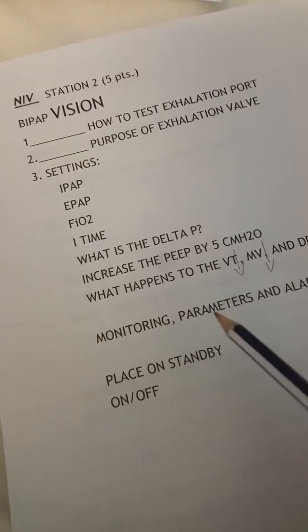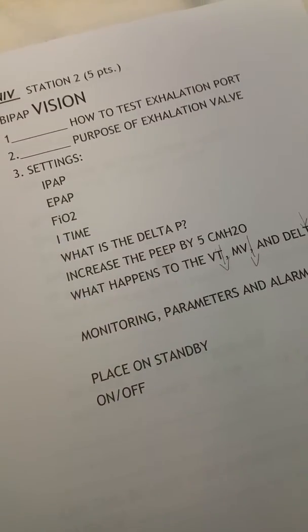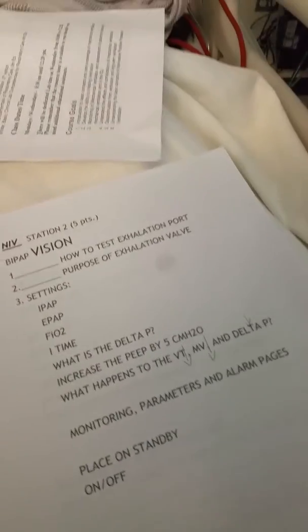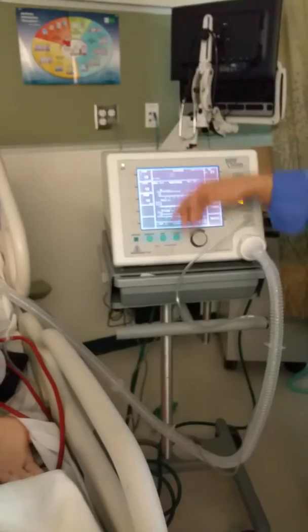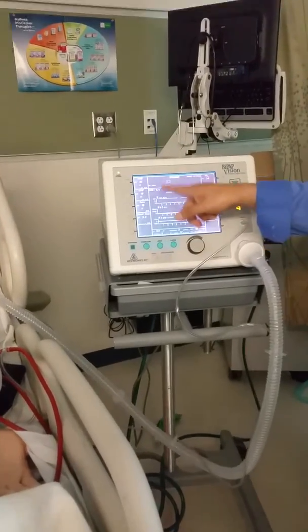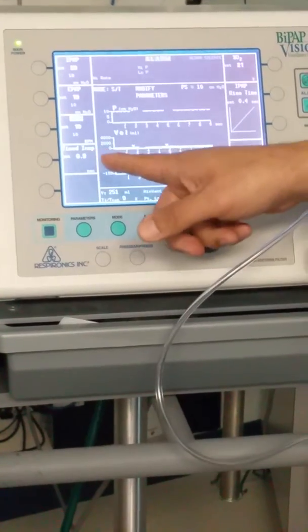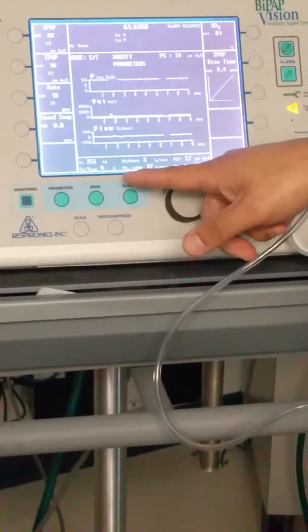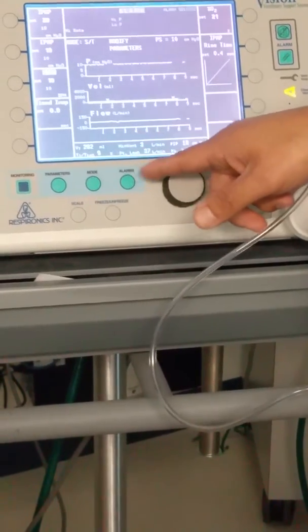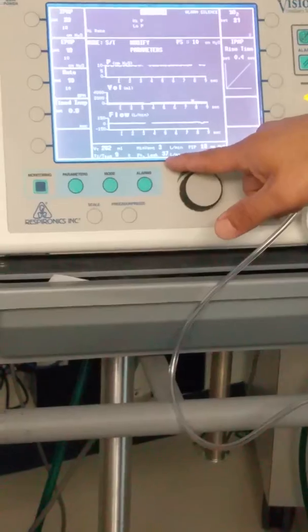Okay, so we have this set. Now I'm going to just pay attention. Again, remember, if I go to monitoring here, I'm not able to change my parameters, which is okay. But if you want to be able to change it, you have to go into parameters, and then you can change things. I like leaving it in the parameter screen because I want to see what my leak is all the time. It doesn't display in the monitoring, it only displays in parameters. And I like to see that. I want to see what my patient is leaking.